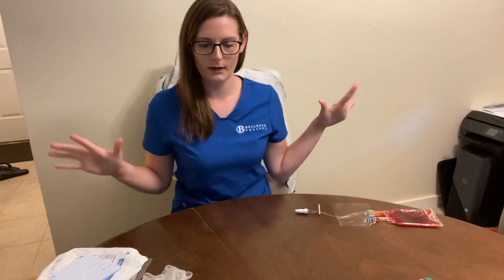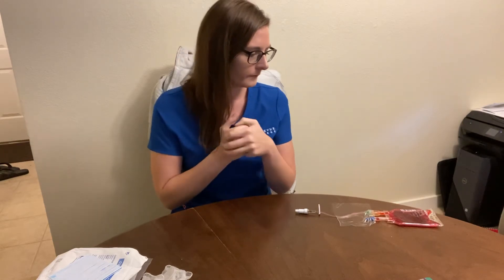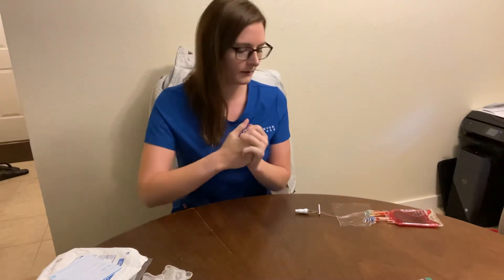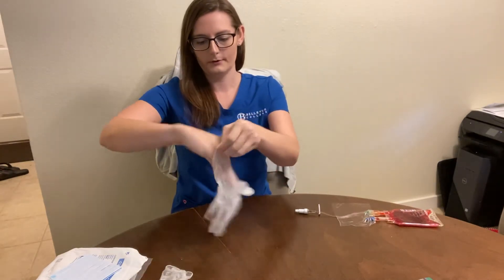I'm going to gather my supplies. I'm going to go into the room, wash my hands, introduce myself, talk to the patient, get his name and date of birth, check the wristband, explain the procedure, and check my orders. Then I'm going to put on gloves.